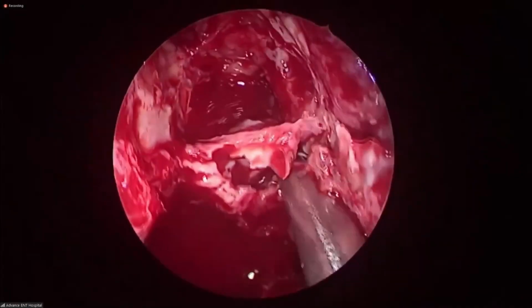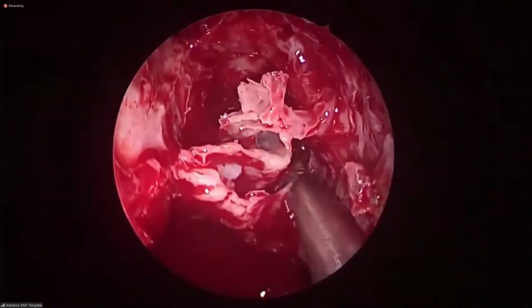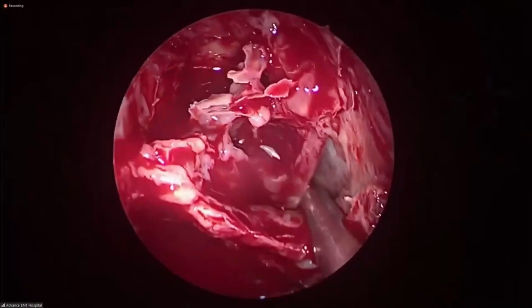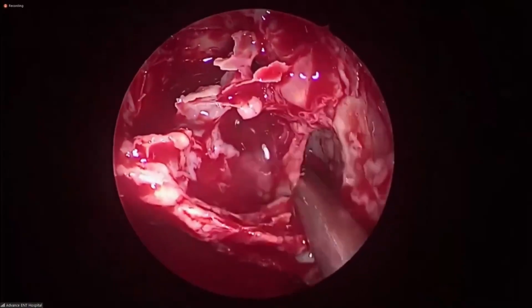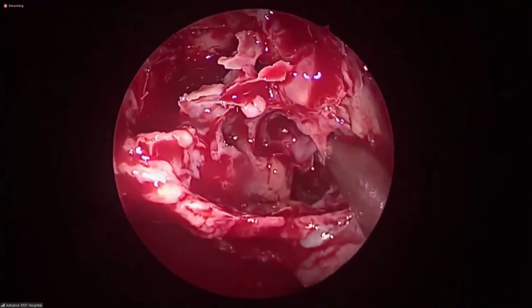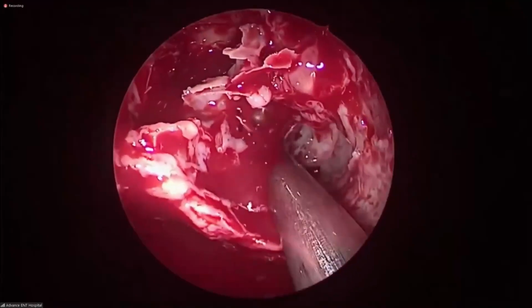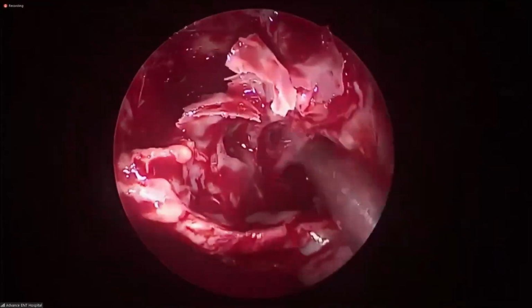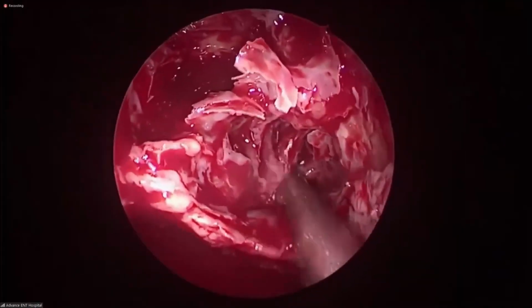This part of the turbinate lower down we have to remove. I left it for the end. See, this is the superior turbinate there. Can you see very clear? Yes, sir. Medially is the septum. This middle turbinate below I am going to remove later. This is the superior turbinate, and these are the lower ones.